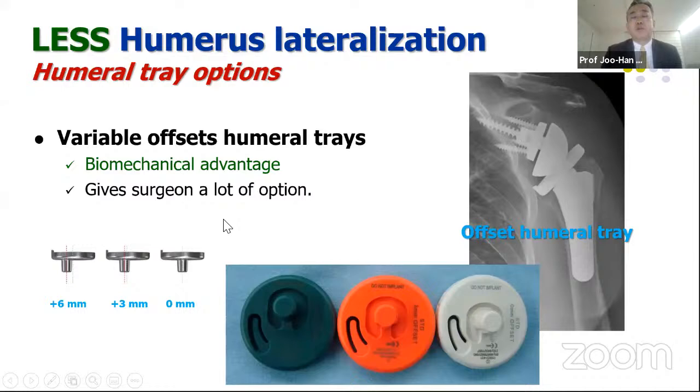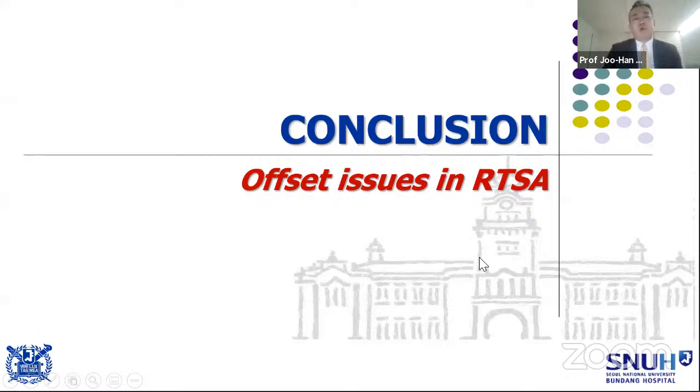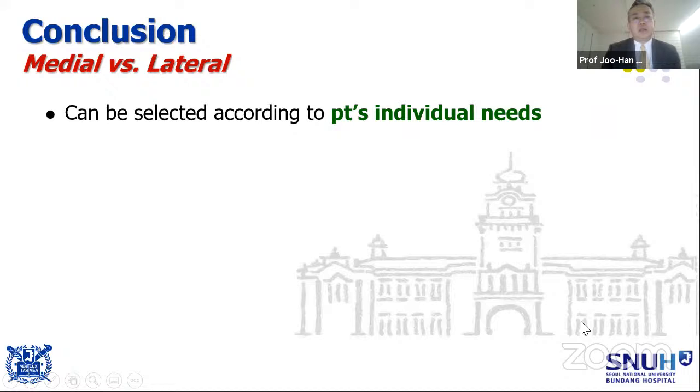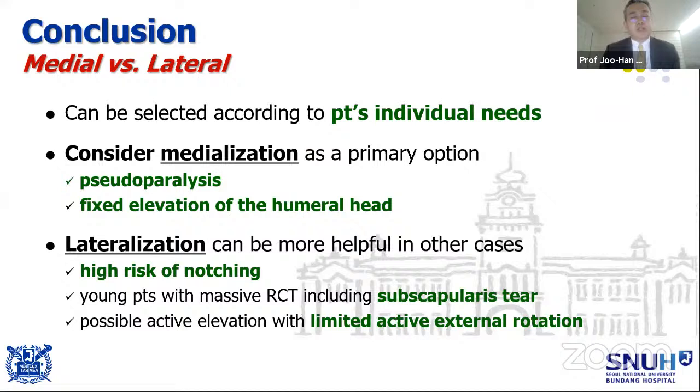This eccentric humeral offset probably causes a little more distalization and a little more medialization with a lateral center of rotation. So my conclusion, in terms of biomechanical characteristics and better outcome, medial or lateral, we can be selective according to the patient's individual needs. In patients with pseudoparalysis or really fixed humeral head elevation, medialization is probably useful. But we have to think about lateralization when the patient has a high risk of notching, such as a scapular neck length smaller than 9 millimeters, or subscap failure, and also really weak active external rotation. Which way, glenoid or humerus?